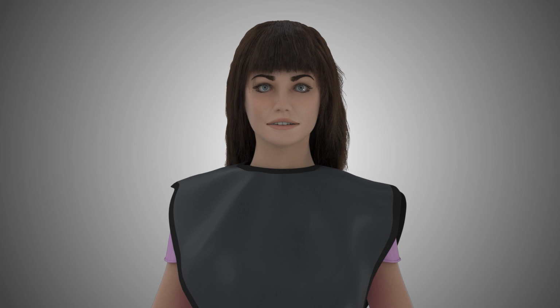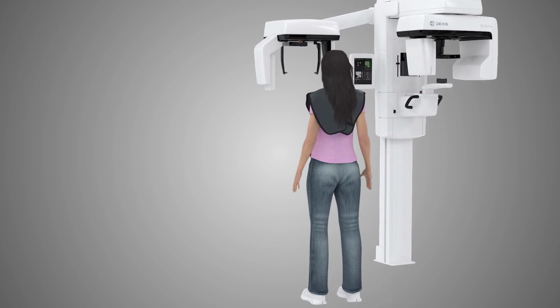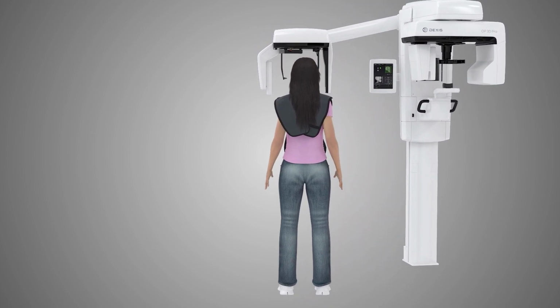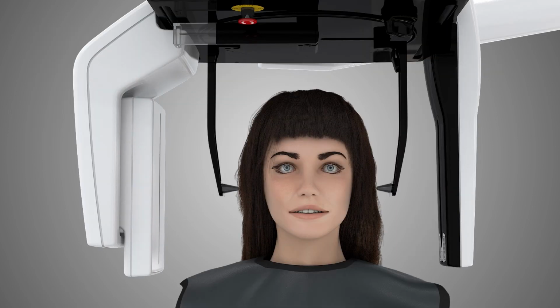Ready the patient for the procedure. Ask the patient to remove any metal artifacts, including glasses, earrings, necklaces, hairpins, or other removable appliances from the shoulders and above. Properly place a protective lead apron over the patient in accordance with local safety regulations and guidelines. Ask the patient to stand as straight and tall as possible in front of the cephalostat head. Adjust the unit height so it is slightly higher than the top of the patient's head using the up-down arrows on the positioning panel.